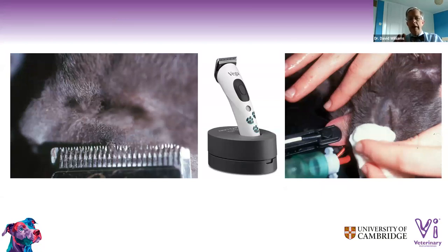And then, of course, is preparing the animal. I hope you've got a small pair of clippers, because they can be really, really useful to clip with. And then, what I would do these days, I get one of those little 250 ml bags of saline, and I put in the relevant amount of povidone to get to 0.5%, or 0.05%, or 0.1%. And then you've just always got it there to draw out and to sterilize your surface before you operate. So just some little things again on how to prepare the patient.